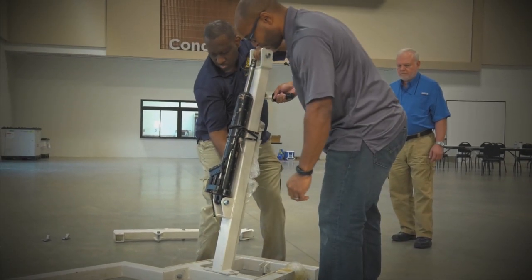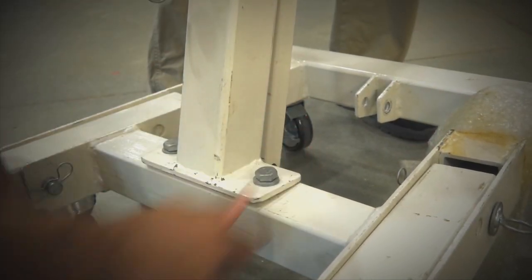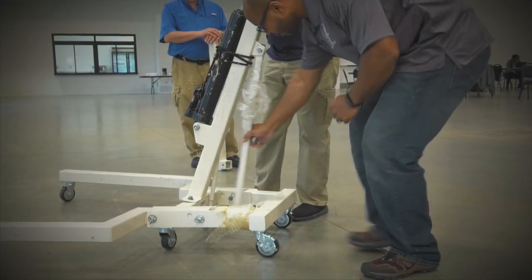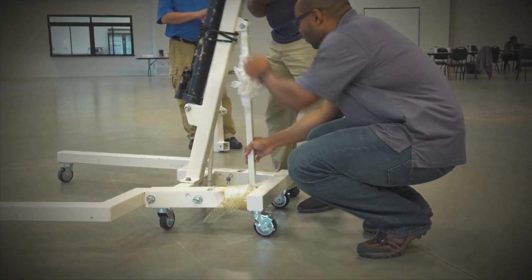Now, attach the center support beam to the base section with two bolts. Next, attach the center support beam brace to the center support beam and the base section.